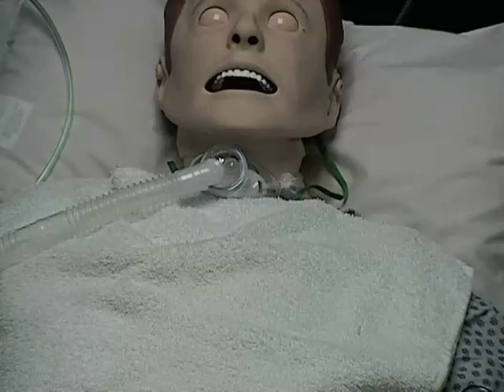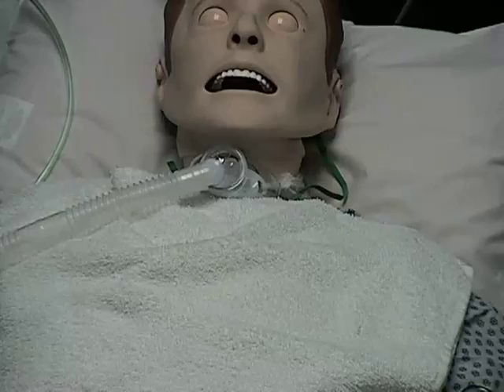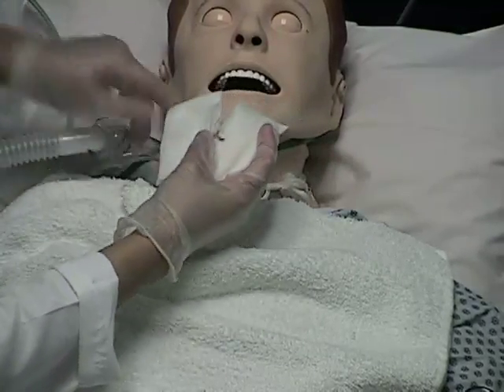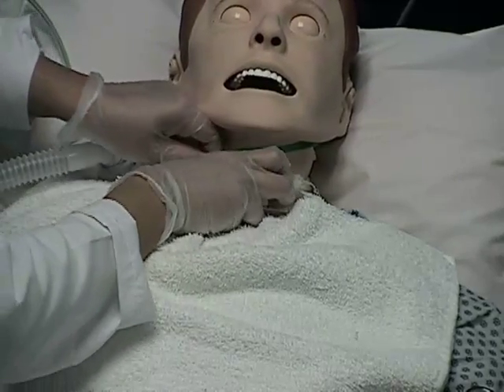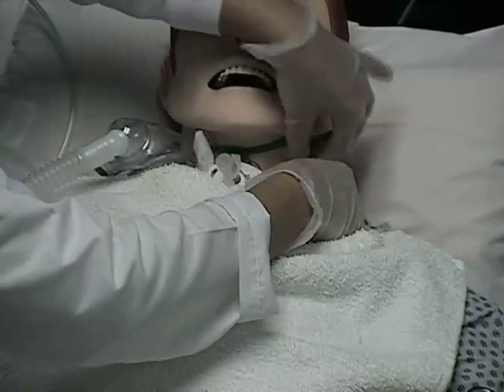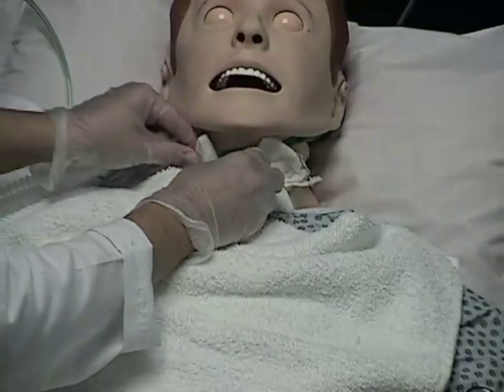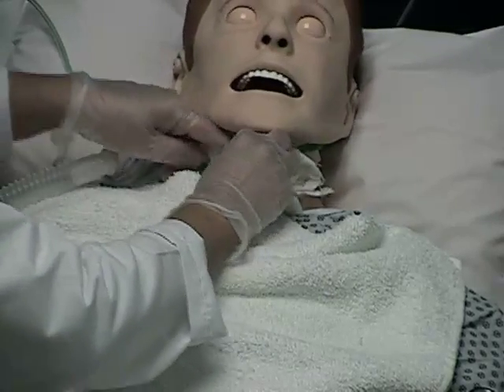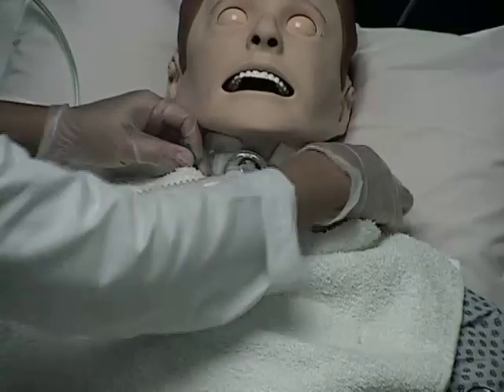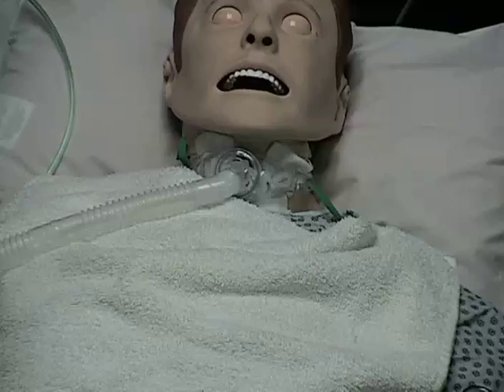After replacing the trach ties, insert a fresh trach dressing underneath the clean ties. Position patient comfortably and evaluate respiratory status.